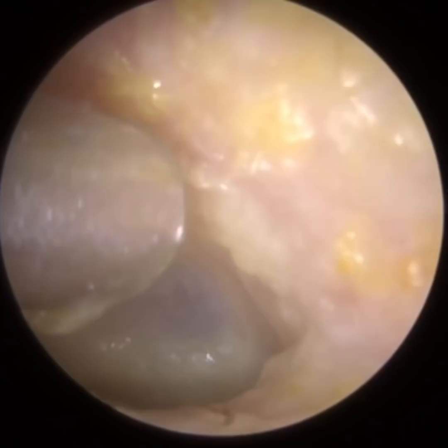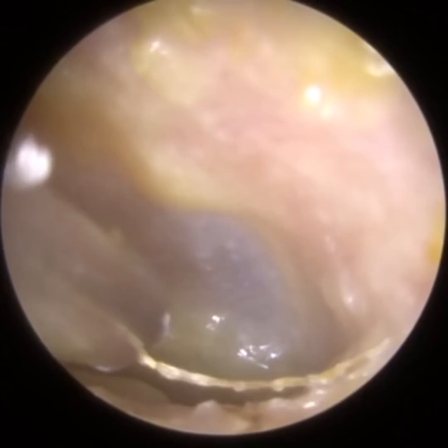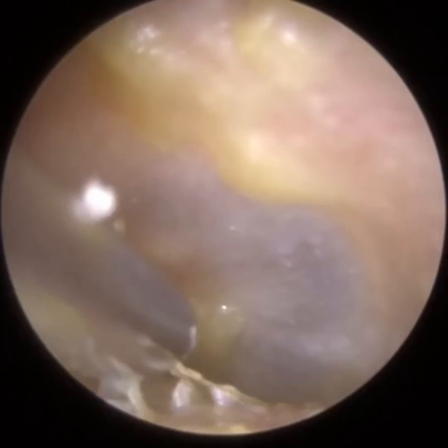The inferior recess is a little basin at the bottom of the eardrum. The anterior recess is a part of the eardrum hidden by the front part of the ear canal — in the case of the left ear, that's the left-hand side of the canal. There's a little trench just to the left, and that's known as the anterior recess. Now let's go through some of the questions.